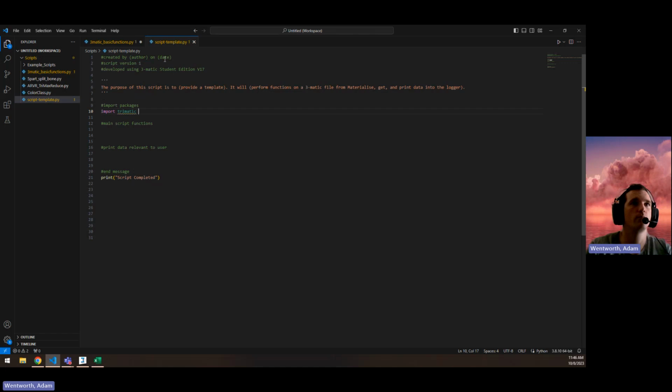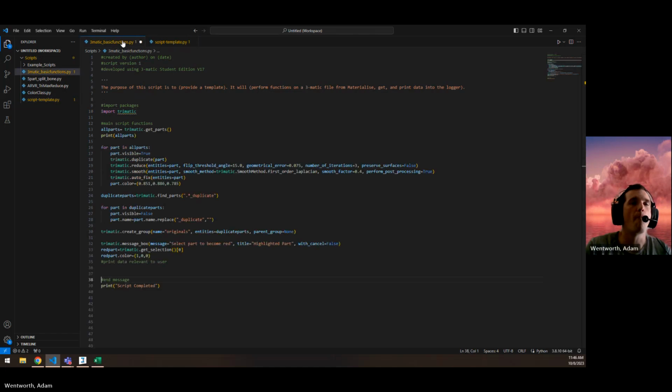So I'll show you one that we've made that will essentially do a series of functions on all of the parts. That includes reducing triangles, smoothing, turning them all a specific color. So maybe if it's all bones, we turn them all a bone-like color. We fix them all, so it gets rid of the mesh errors. We duplicate the original objects.